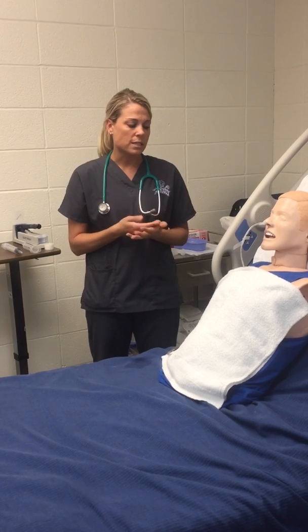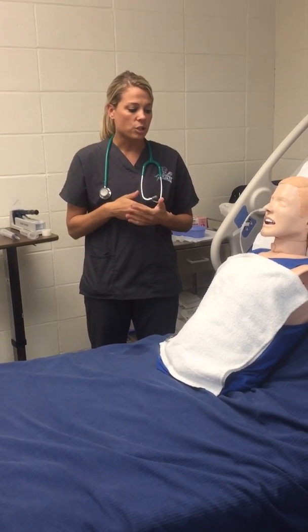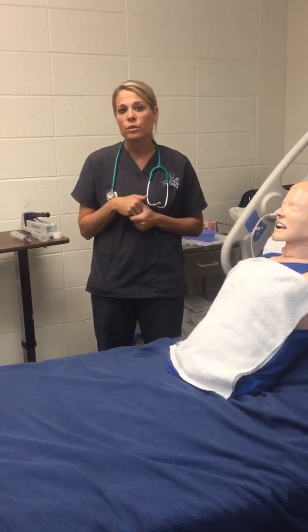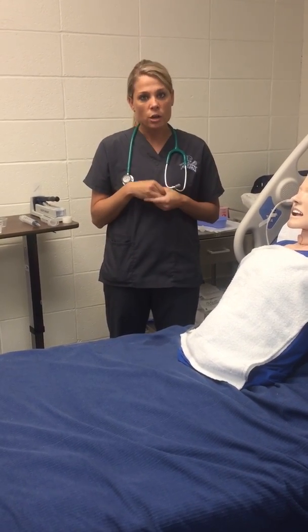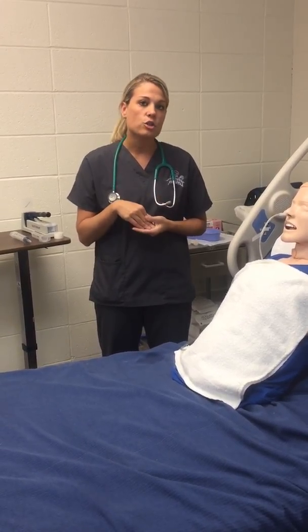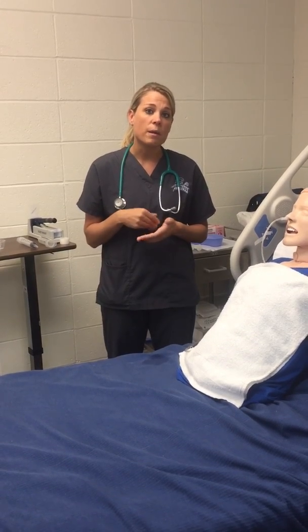And then I would also assess to see if he has any nausea or vomiting before administering medications. I would gather all of my supplies. I would grab the medications that are ordered for this time, and I would make sure that they are crushable before crushing them, and complete the 2 medication checks before entering my patient's room.